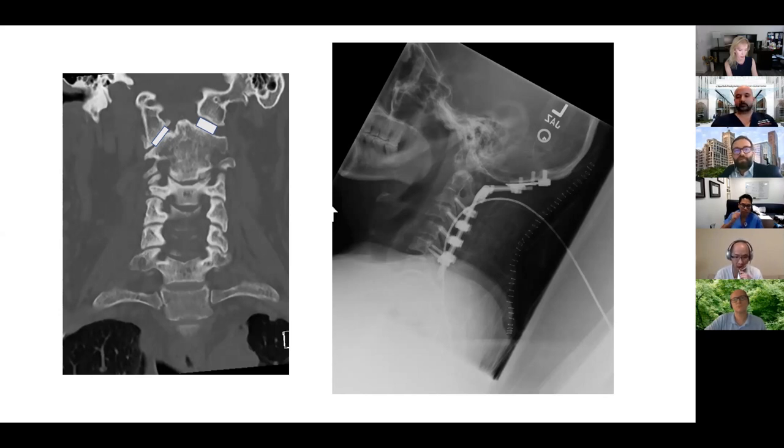You have to make an effort to shave it as much as you can so you can get a bone fusion. If you don't, that's okay as long as it fuses in the back. So anterior support here, and then use BMP or bone or rib graft. Here I tie it, if it's a rib graft, with a silk to the construct on both sides. And here the opportunity for fusion is not bad because there are no C1 screws, no C2 screws. There's a lot of bone that you can see that can be burnished, and you can put a lot of bone to help bridge the gap.